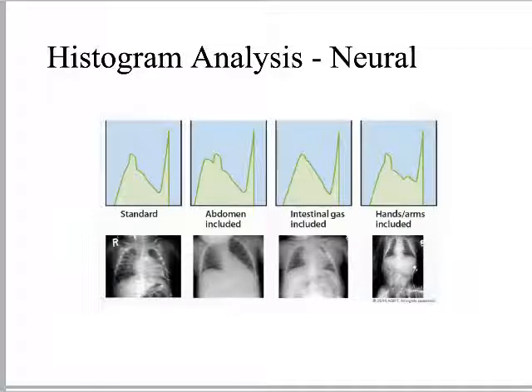So that's what we're talking about when we talk about telling the computer what we're thinking about. If you tell it, I want a wedding picture, but you give it the Joker, right? The lookup table is going to actually mess things up. If you tell it you want the Joker's makeup for your lookup table and you give it a wedding picture, it's going to mess things up. So be really careful in what you're selecting at the control console.